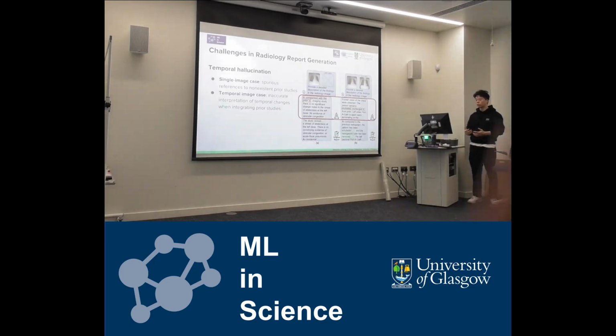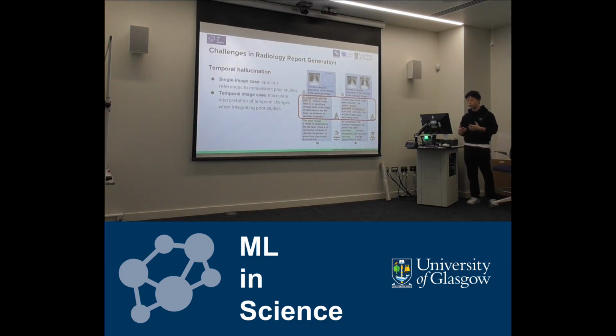At each turn, the model focuses on answering a question about a single image and generates the corresponding report for each image. Finally, the model needs to summarize them together. This may sound reasonable, but it relies heavily on the language model's ability to distinguish different images and reason over the temporal relationship.